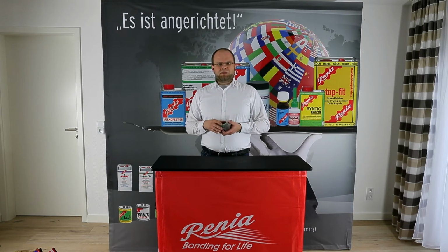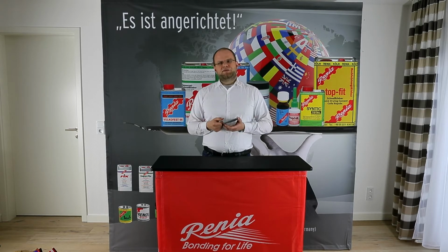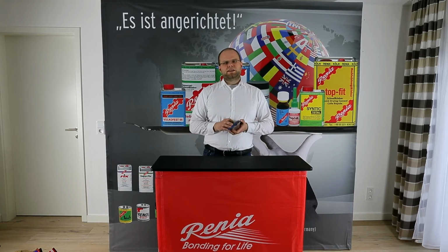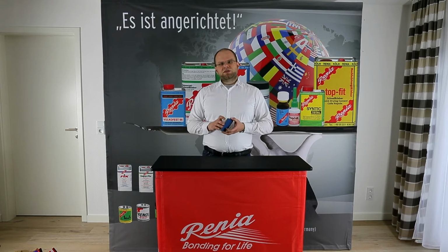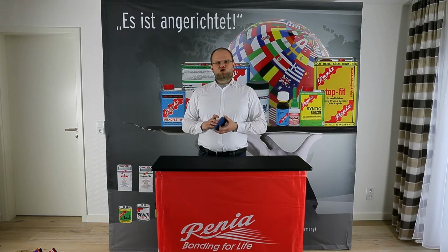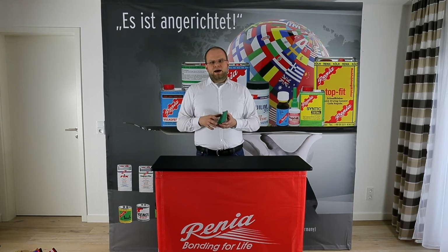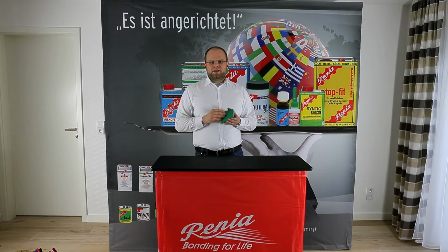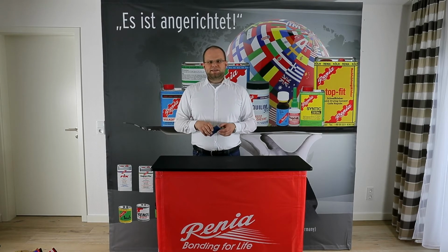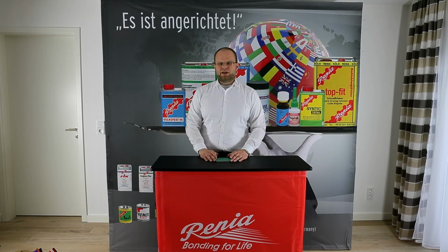This is, of course, something that makes surfaces non-sticky, and that counteracts the effects of the adhesive. So before you bond, if there's mold release involved, that needs to come off. Which leads us to the second problem. This material reacts to solvent by crumpling up, curdling up. So if you try to clean this with acetone or thinner, in many cases you actually start dissolving the material. So that's not necessarily the best option.